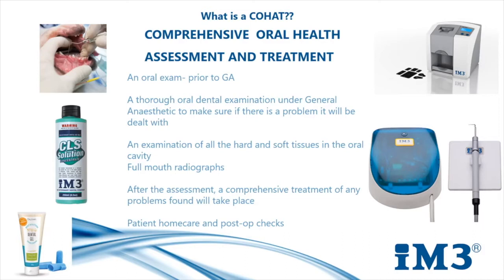A COHAT will include a detailed oral exam and charting along with ultrasonic scaling above and below the gum line, irrigation and polishing the teeth afterwards using a low-speed handpiece. Full mouth x-rays are necessary for accurate diagnosis and treatment.